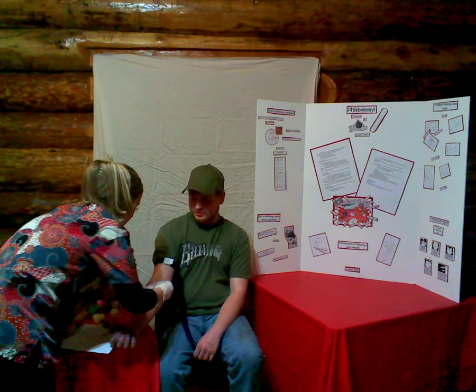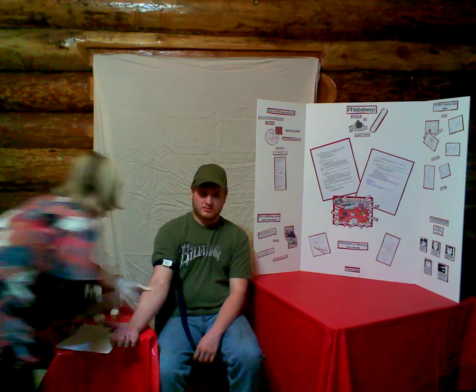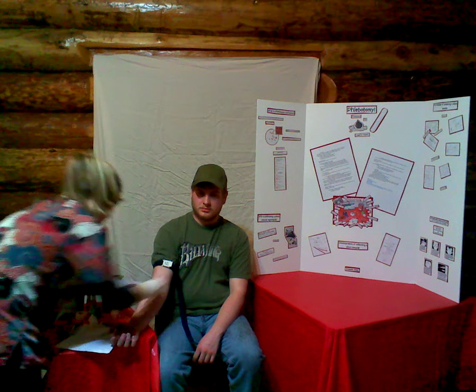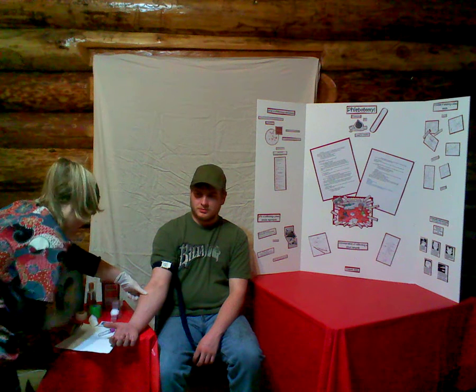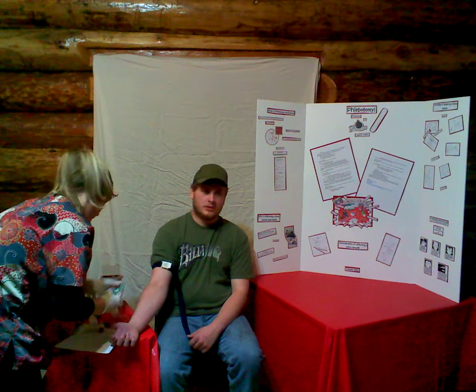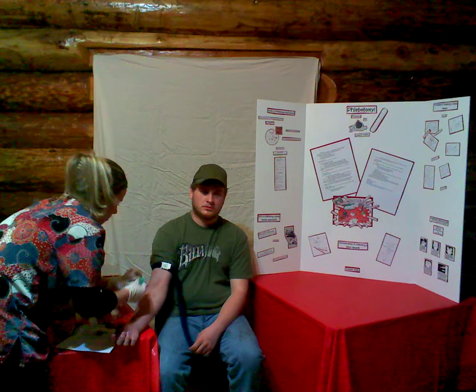I'll clean the site. Have my tourniquet in place. I'll grip the needle holder with the bevel side of the needle up.